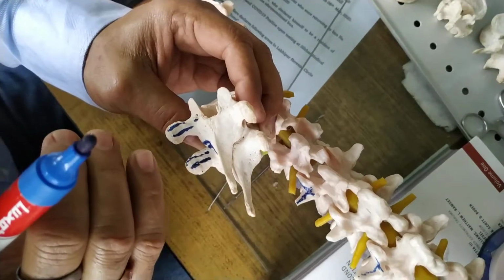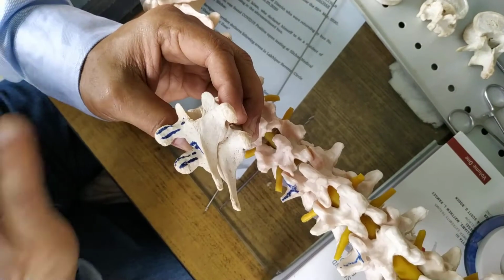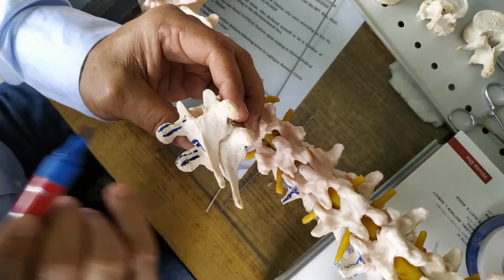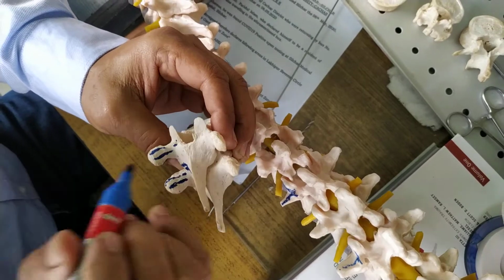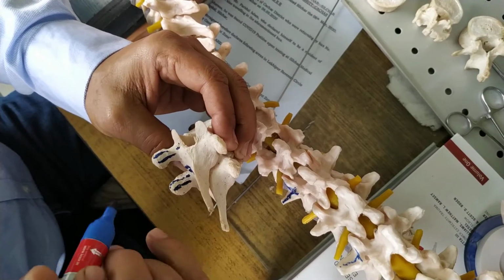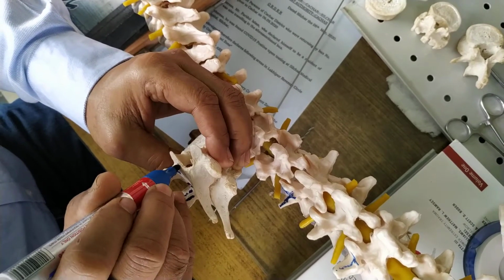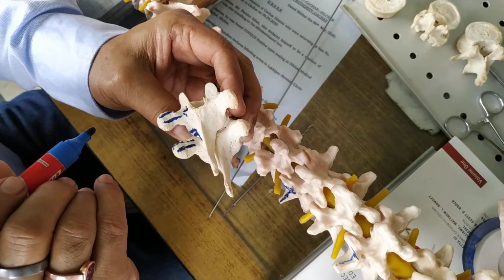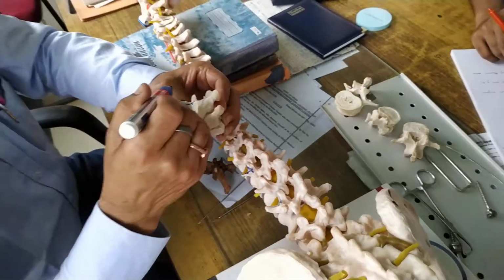You are deroofing it because your inferior articular surface is overlapping it, you are excising it. So you have exposed this part. You know the medial border here, you know the lateral border here. Now find out the midpoint of the base of your superior articular surface. Okay, sir? So this is the area.